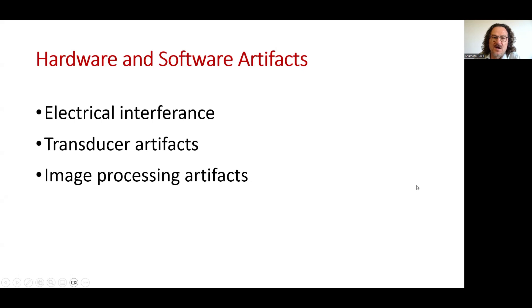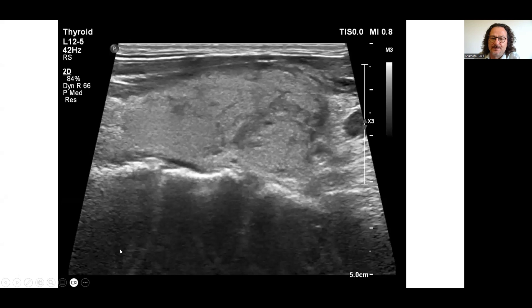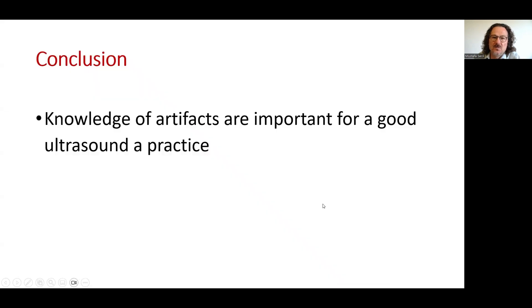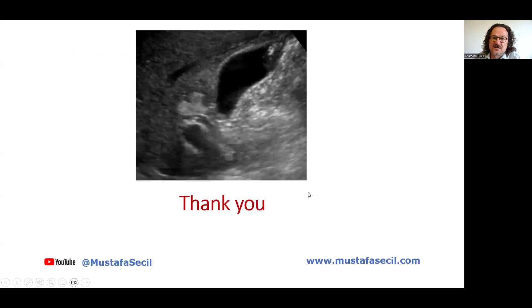There may also be hardware and software artifacts. Electrical interference is a common one, particularly when fluorescence lamps share the same electrical line as the transducers. This is an older device causing artifacts — called a connector artifact — where some of the lines are not working properly. Knowledge of artifacts is important for good ultrasound practice.